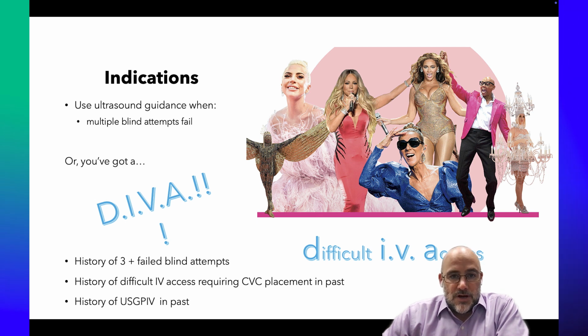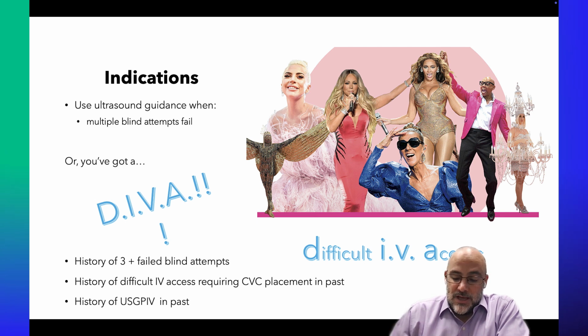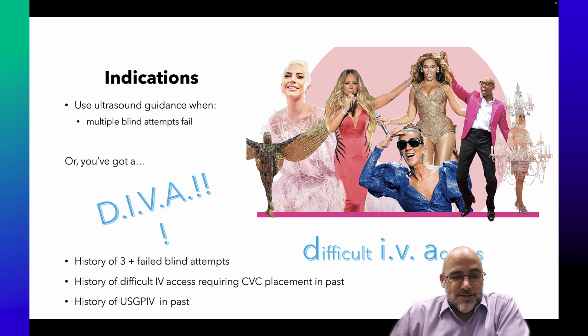Now, of course, here we can run into a little bit of self-fulfilling prophecy, much like the original Top Gun. If you become too reliant on missiles, in this case ultrasound, then you lose your dogfighting skills, which is to say your blind stick skills. So we want to be careful that we are still able to practice our blind stick skills in a pinch, because ultrasound may not be appropriate for all situations, and we don't want to become dependent on it.